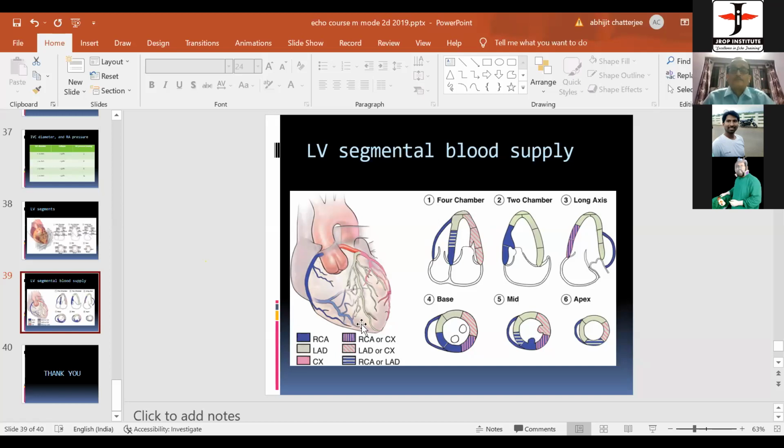Myocardial performance index. And he said myocardial performance index, can we take from tissue Doppler only, or we have some other method of doing MPI? You can do it by conventional Doppler, like pulse wave Doppler. You can also do it by tissue Doppler. The normal values are slightly different from one another. Can you show the method? Yes, I'll show you the method.